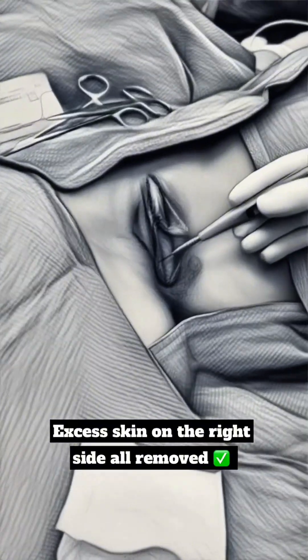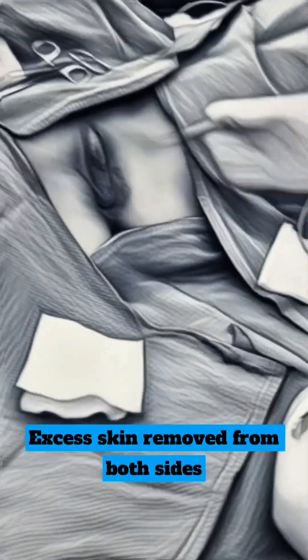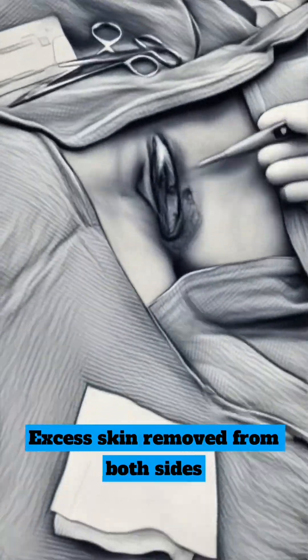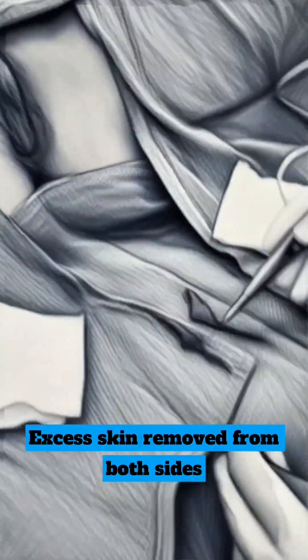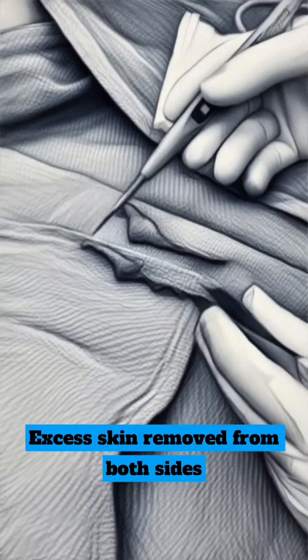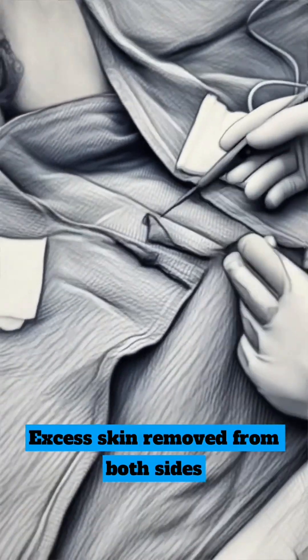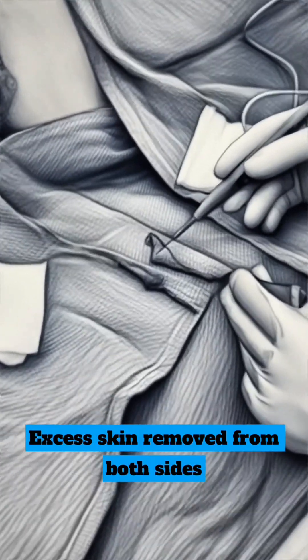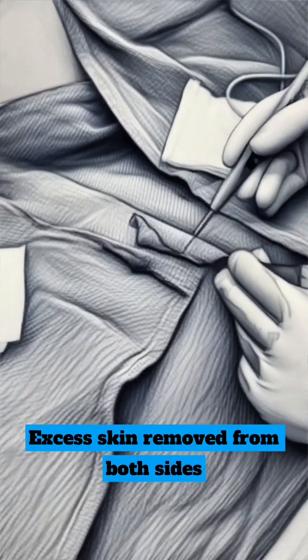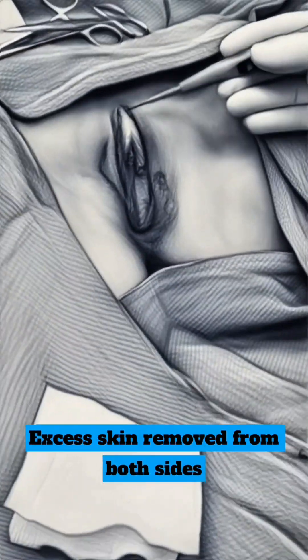It's much nicer now. I've removed tissue from the other side as well — nice and smooth. You can see this is her left labia and this is her right labia. Two different labias, so they look a little different when removed. Most of it is middle to anterior. The posterior part is pretty thin, which is a very small resection. Nice and smooth now, no more projection.